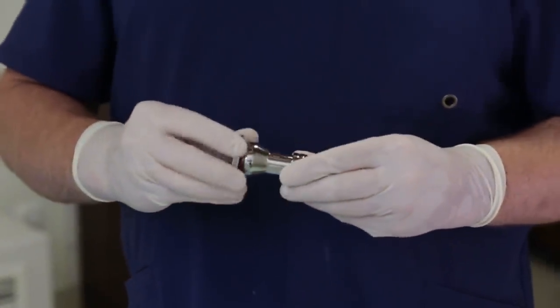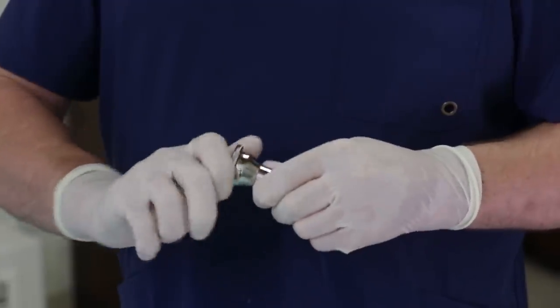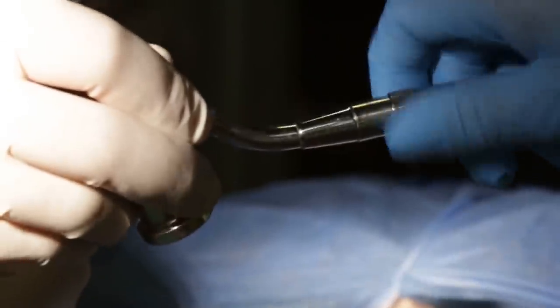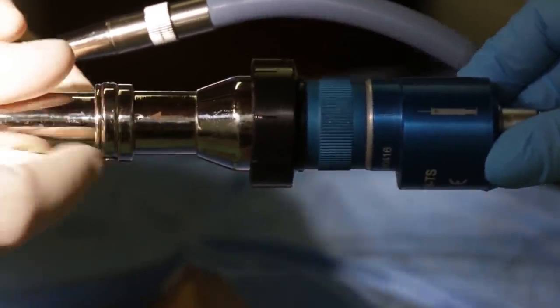The next step is assembling the multi-use anoscope and connecting it to the light source and the camera.